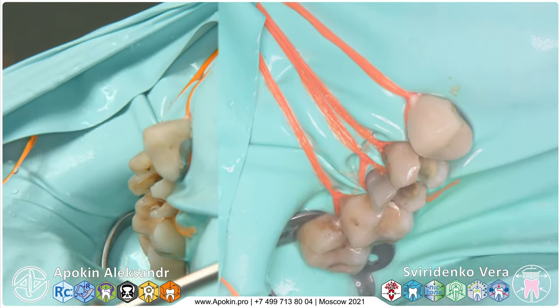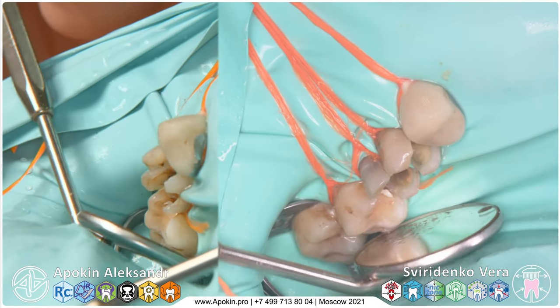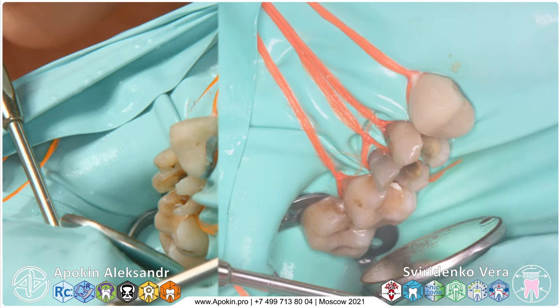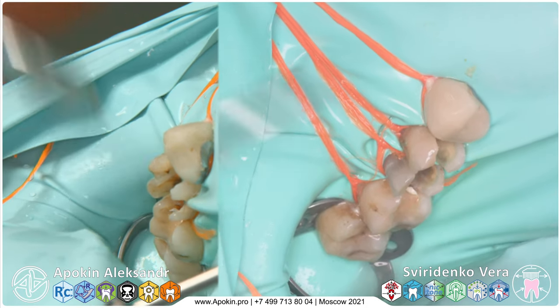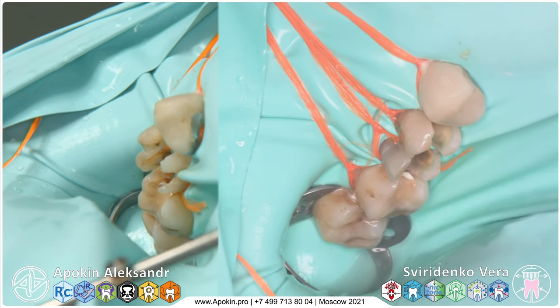Caries indicator. We apply caries indicator to all pre-prepared surfaces.